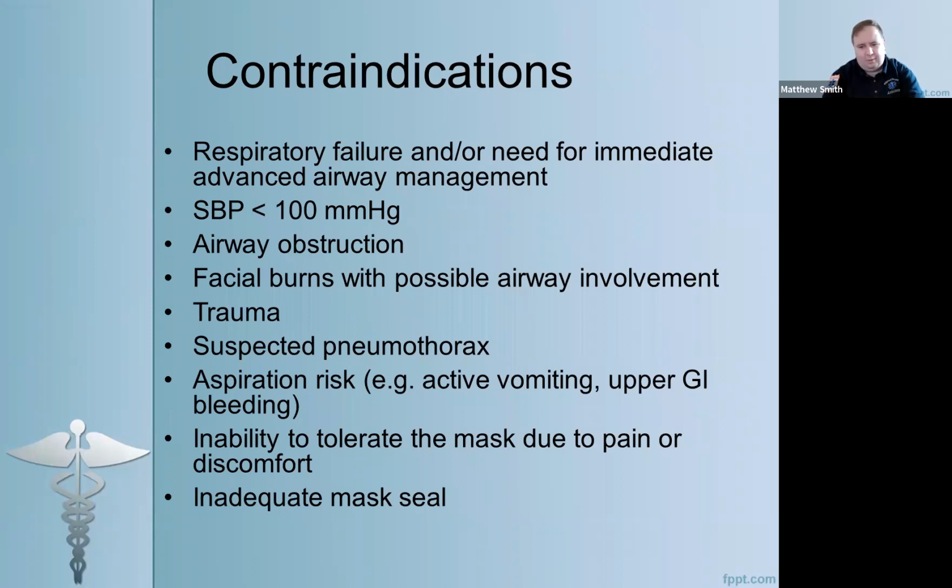Facial burns with possible airway involvement. There's concern there for swelling of the upper airway, and CPAP could irritate that tissue, make swelling worse, and it also decreases our ability to assess it. So for those reasons, we're not going to use it in facial burns with possible upper airway involvement. Trauma, there's concern for the potential to cause a pneumothorax because there could be some sort of a rupture in the integrity of the visceral pleura.